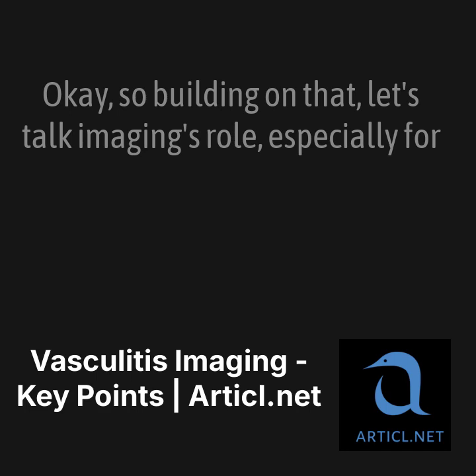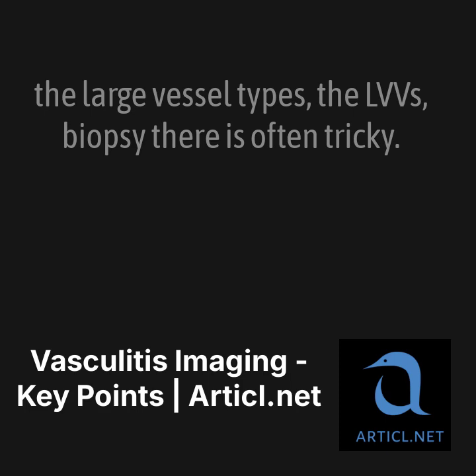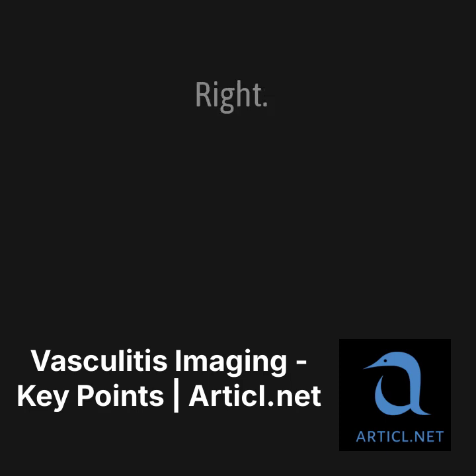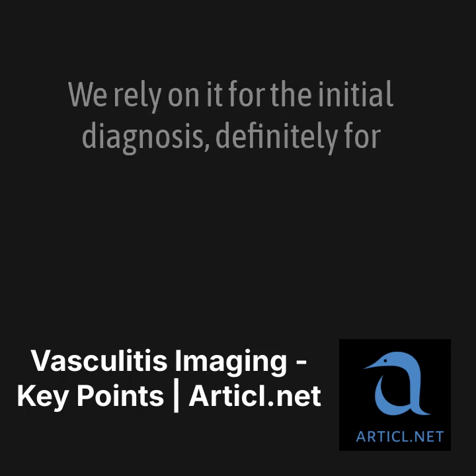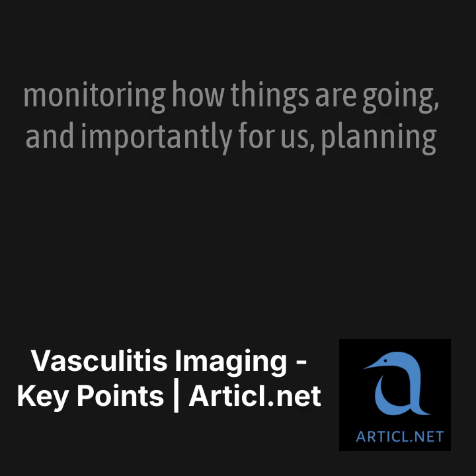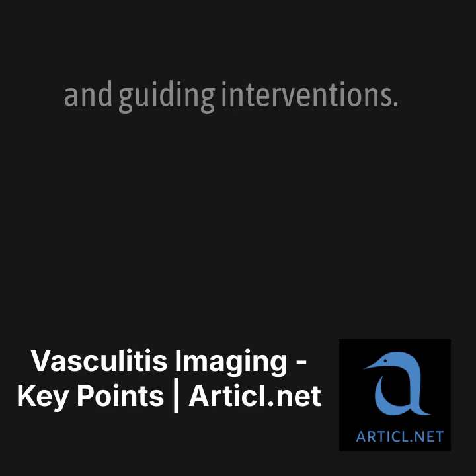Okay, so building on that, let's talk imaging's role, especially for the large vessel types, the LVVs. Biopsy there is often tricky, right? So what's imaging really doing for us? Oh, it's absolutely critical. We rely on it for the initial diagnosis, definitely for monitoring how things are going, and importantly for us, planning and guiding interventions.